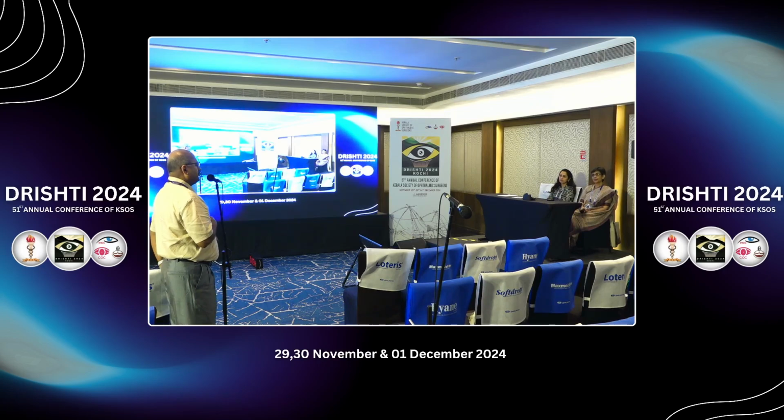Unless you have the record, you won't be able to make out. If it's been done very aggressively, for example, if you've used very high laser energy, then you will have those spikes, the sawtooth sign, PAS will form even with SLT. If a novice has done it and used a higher energy level, you will find it, but if it's done with the optimum energy level recommended by the company, then you don't find any sign at all.